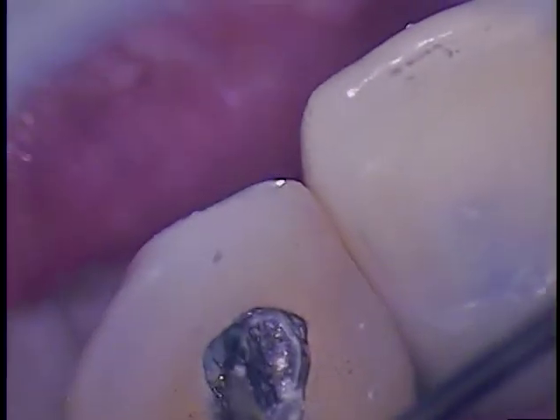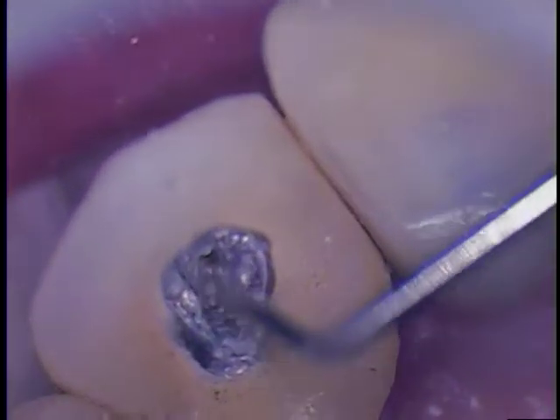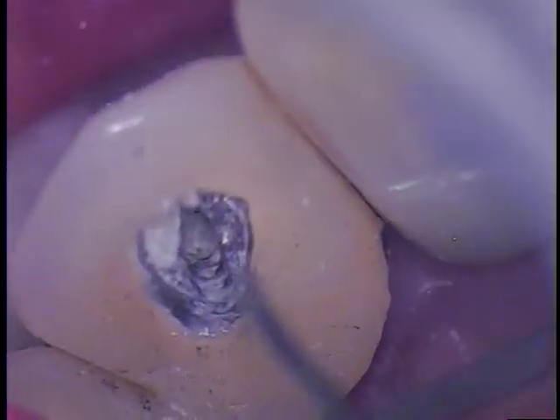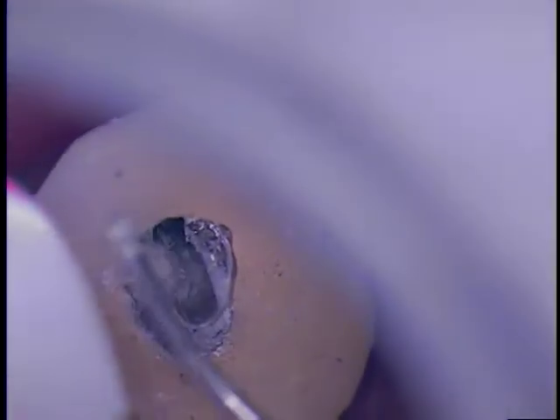Maybe we can remove a little bit more of the cement internally. I'm getting all the way in there, pushing and stabbing at the cotton. It's a big cotton swab in there — most of it is protecting the head of the screw. I know where it is. The cotton is soaked with that material, so it's doing its job loosening up the cement. Perhaps I'll just leave that well enough alone.